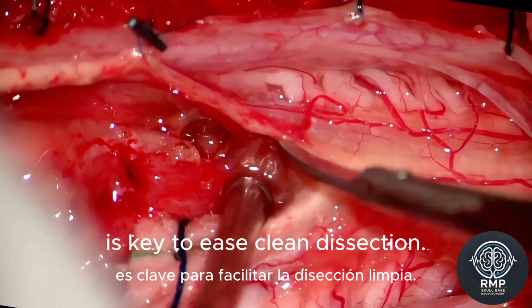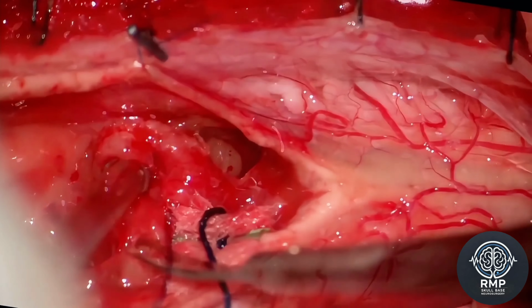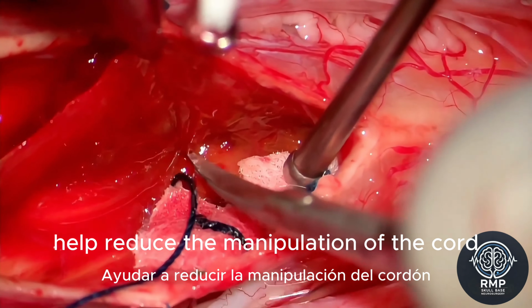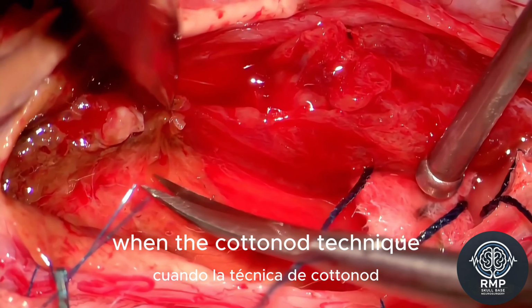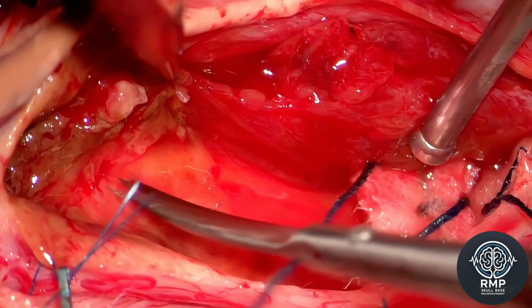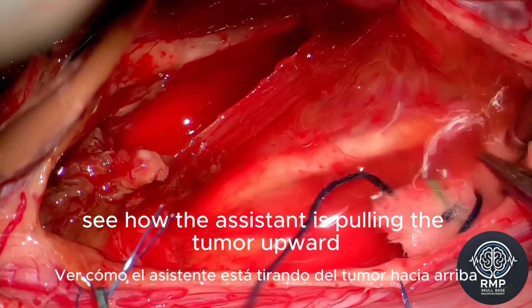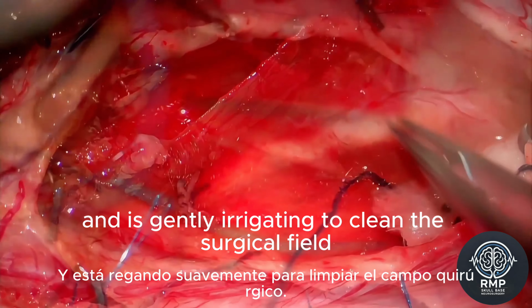Preserving the tumor capsule is key to ease clean dissection. Maneuvers of countertraction by the assistant help reduce the manipulation of the cord when the cottonoid technique or traction with pia stitches are insufficient. Finally, when we reach the back of the tumor, see how the assistant is pulling the tumor upward and gently irrigating to clean the surgical field.